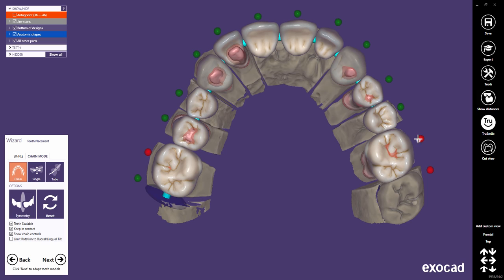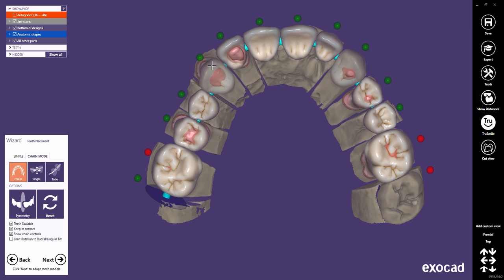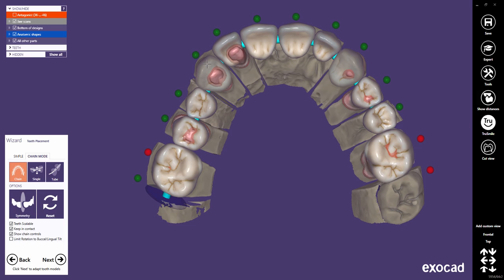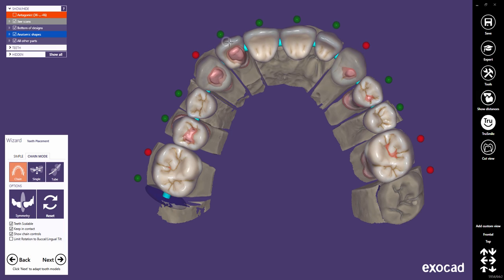As I already mentioned, I recommend placing the last teeth first and locking their positions. Then continue in chain mode with the canines — each time you're happy with a tooth position, pin it. Next, finalize the anteriors' positions in chain mode, or switch to single mode to do some fine tweaking.